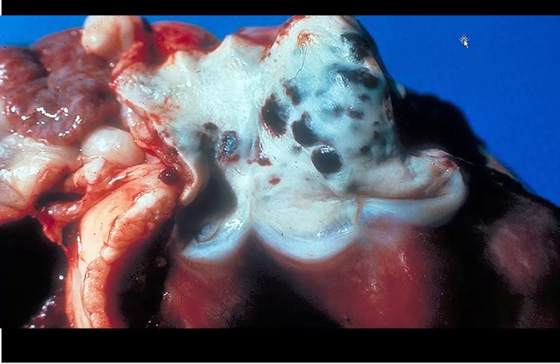Here's one where real life may interfere with your diagnosis. This is a classic lesion, the pulmonary artery hemorrhages in blue tongue. But in real life, every time you see that, you don't have to go crazy and say, I got blue tongue, which is a reportable disease, because you can see a very similar lesion with enterotoxemia in sheep.